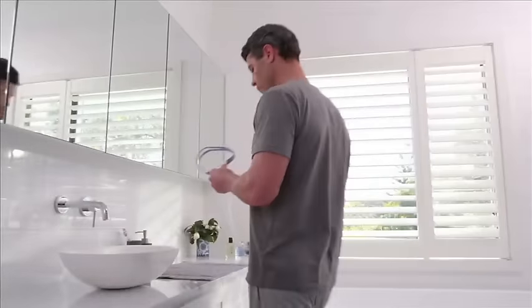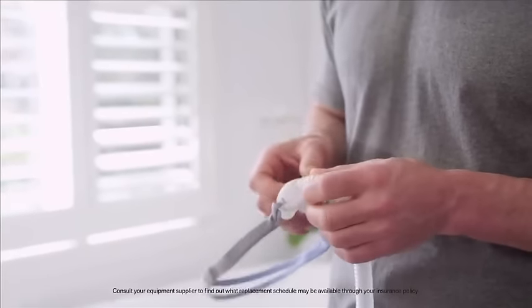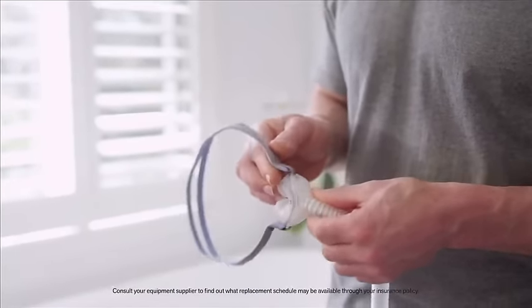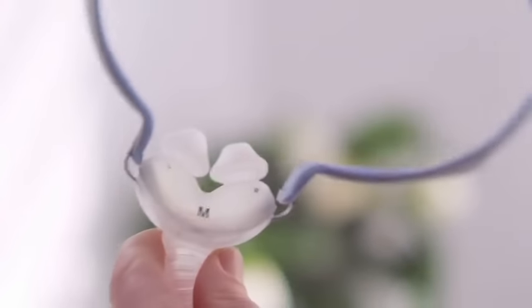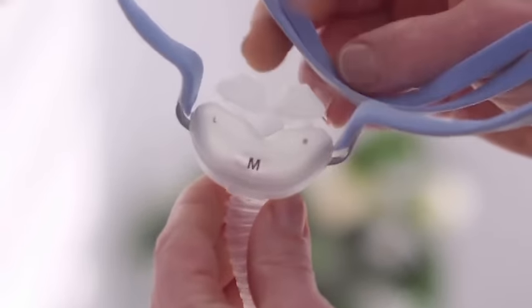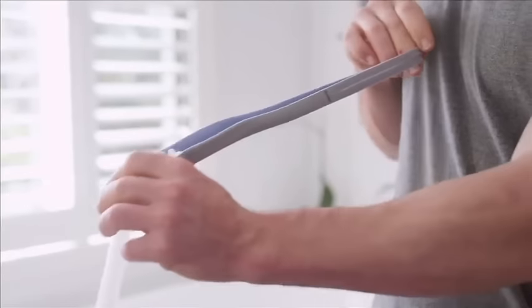Replacing your mask and individual parts at recommended intervals is one of the most important steps you can take to maintain effective therapy. It's time to replace when the mask's frame is damaged, if the pillows are cracked, torn, or damaged in any way, or if the headgear is old and no longer returns to its original form.